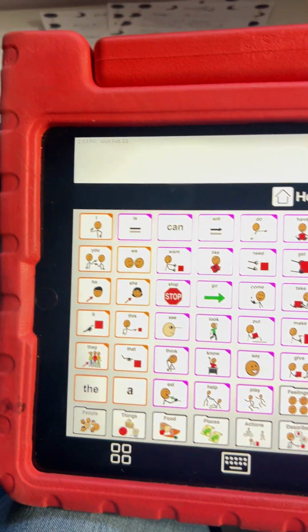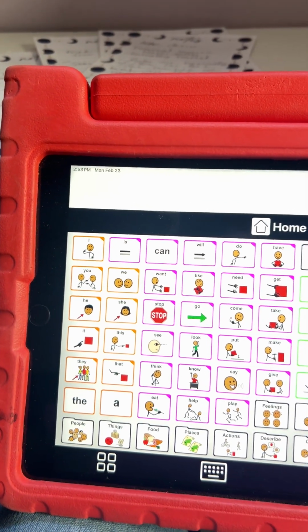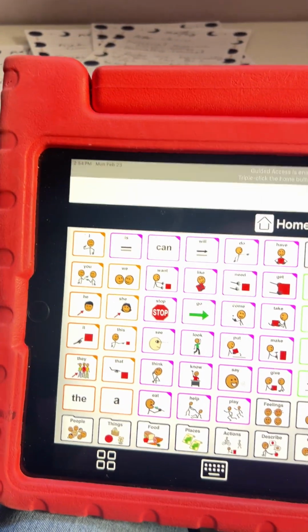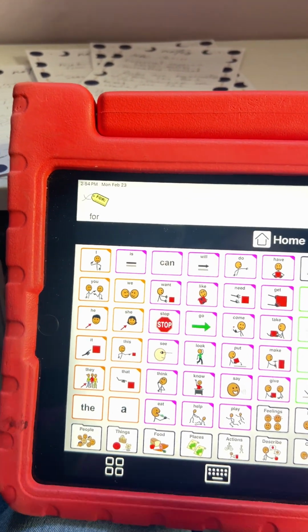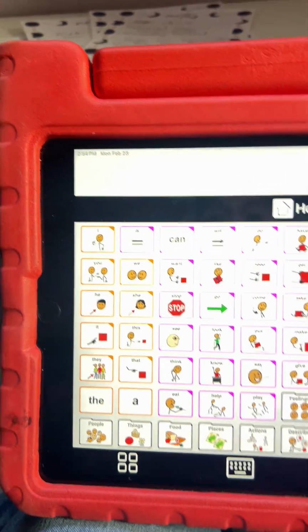And I really want to give you the goals and tips that I feel like have been really great for me. So in general, of course, the AAC device, it speaks, right? It's a speaking device. It's a communication device, and it actually speaks for the client.